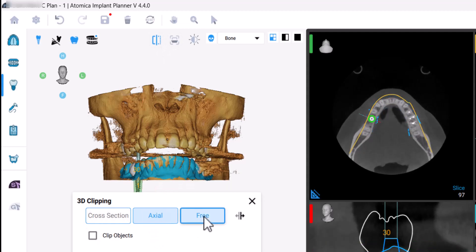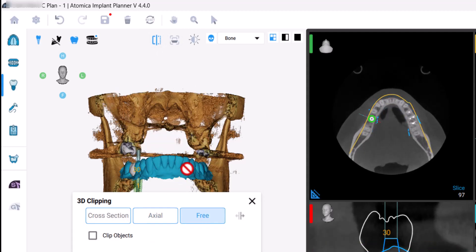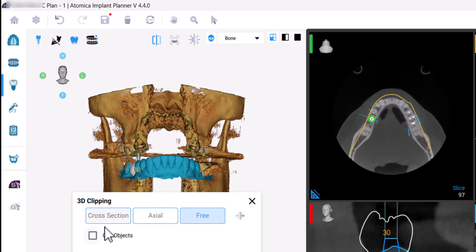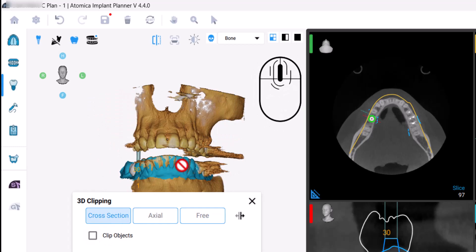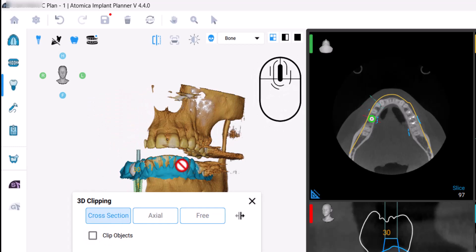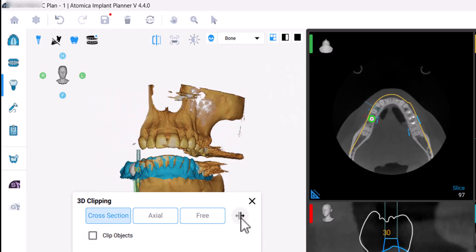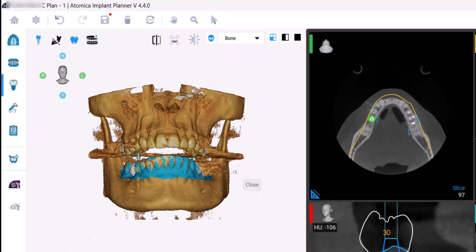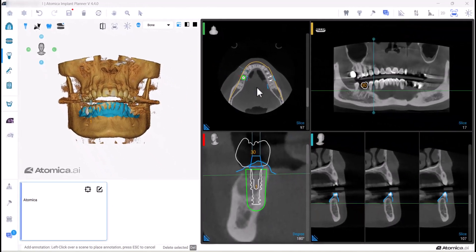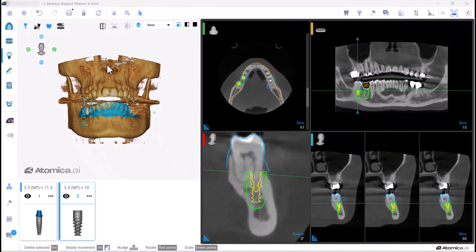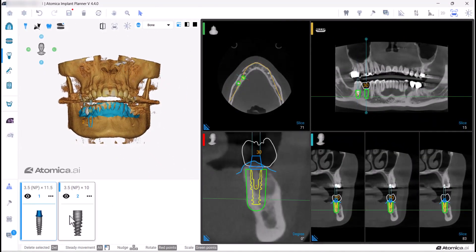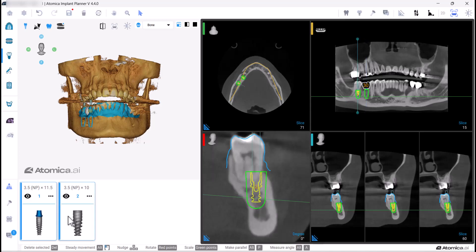Mark the direction you want and use your mouse scroller. You can also reverse the clipped area easily. When planning multiple implants, you can measure the angle between them — select the first one, then hold the Control button and select the other.